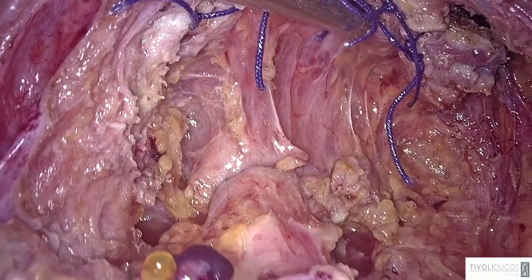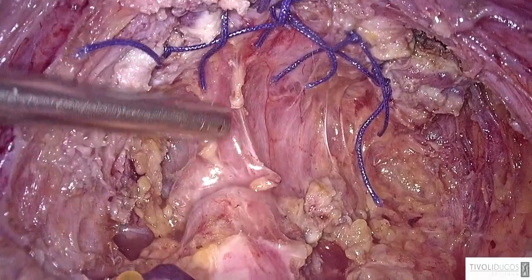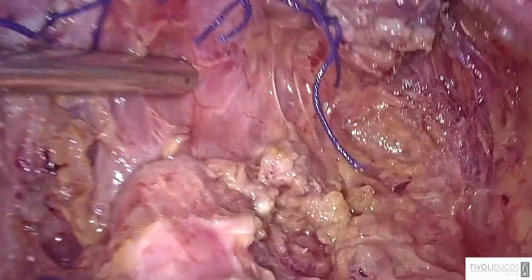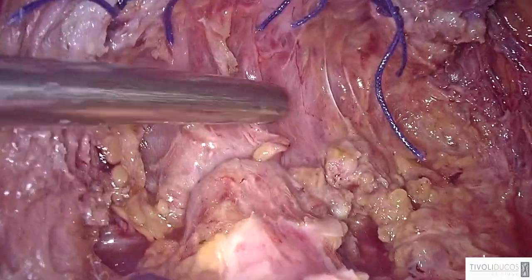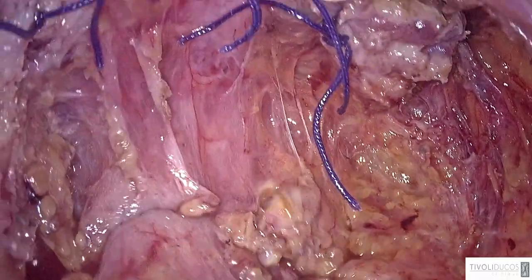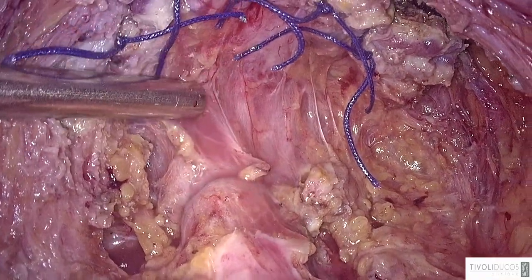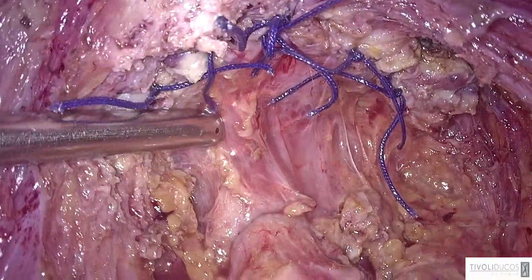We can carry out disc excision up to 6 centimeters, but we are more performant in large disc excision when the low rectum is involved, because we have a second technique, which is the Rouen technique, using a semicircular stapler. With this semicircular stapler, we can remove patches as large as 6 to 7 centimeters in diameter. So the size is not actually a problem.